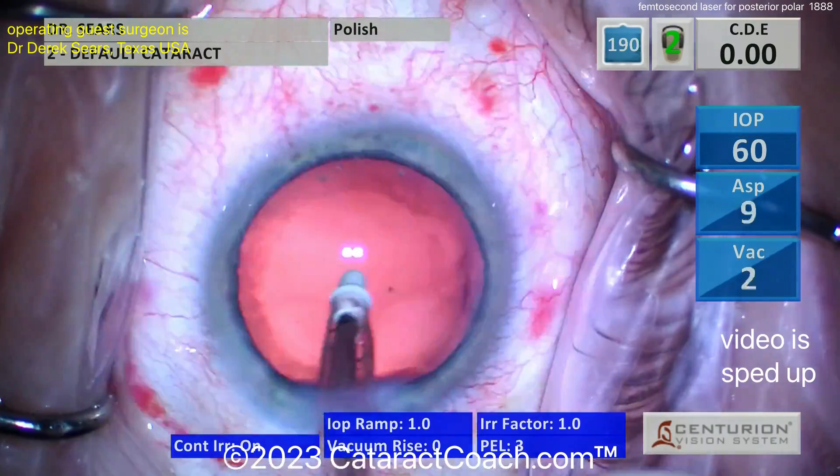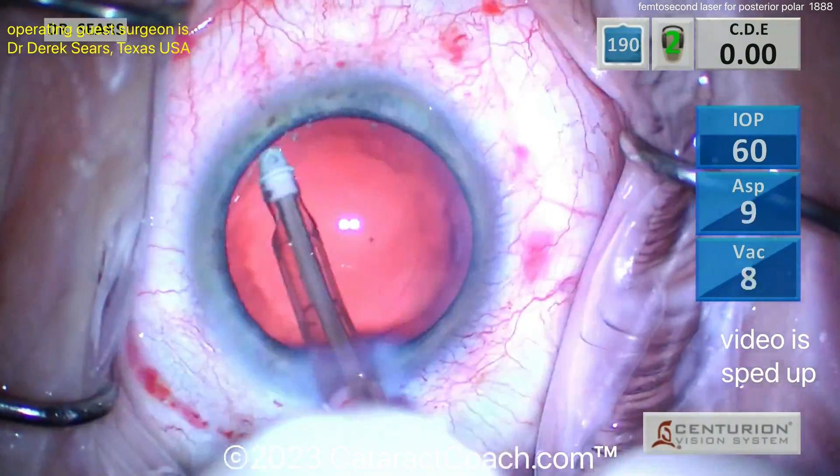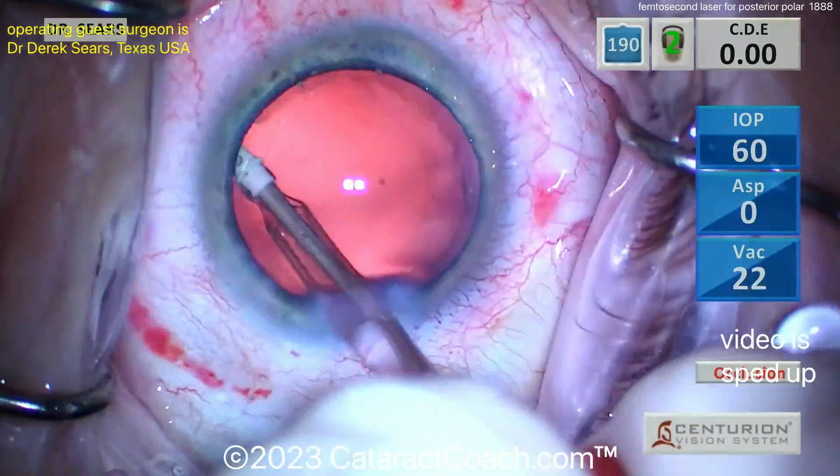All cleaned up. We obviously sped up the video — I like to mention that and put it on the screen, just so you know that we all take our time for these surgeries, there is no rush. Capsular bag polishing — look at that, I like it.